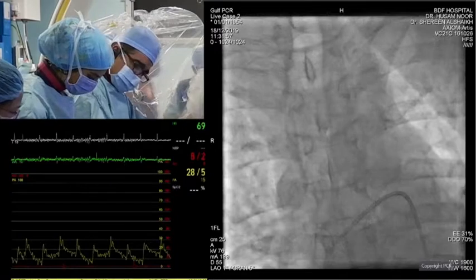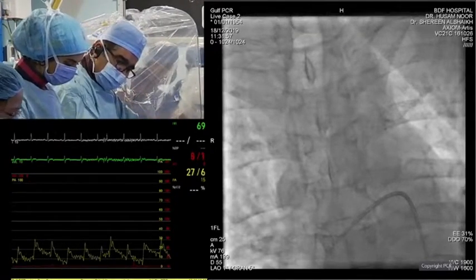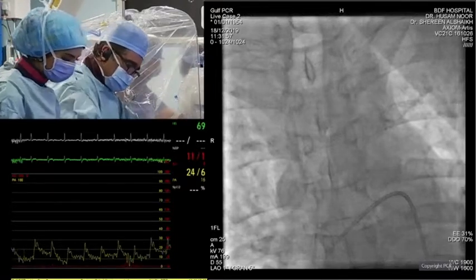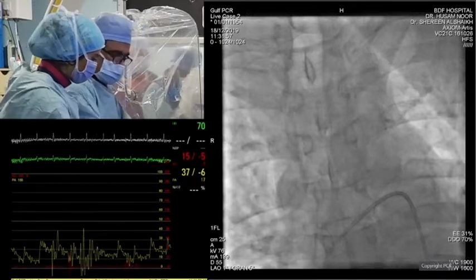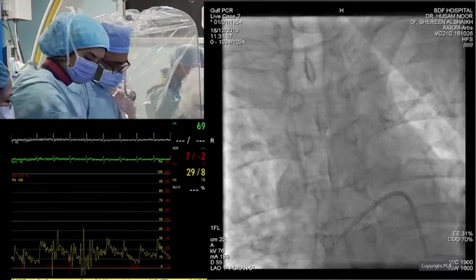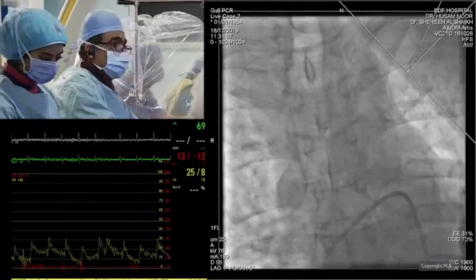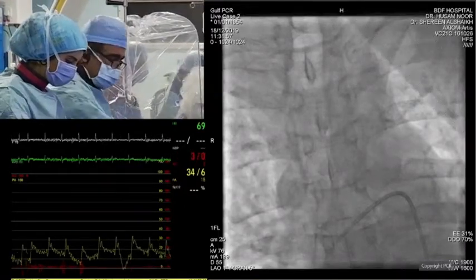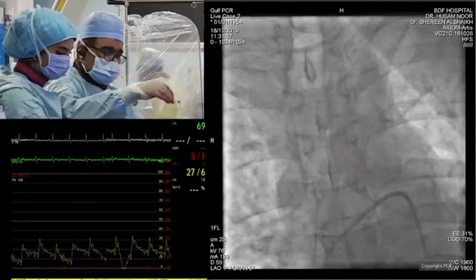So in an area of a scar, we have to be careful how to interpret lesions to flow. But also, that RCA was supplying the LAD as well. You can see the collaterals from the right to the LAD. So if anything, it could have been, in a way, falsely positive. Yeah, it's an important point. He has inferior akinesia. He had this lesion on the proximal LAD. There is some collateral flow from right to left. How do you interpret the FFR in this particular case? What are the risks of misinterpreting the result, positive or negative?